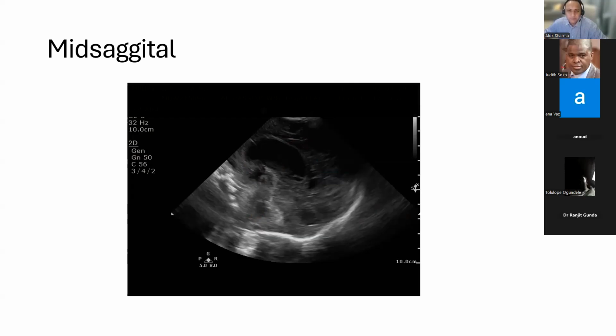Now he will be 34 weeks plus, I think 3 days, like this. Yeah, so you're basically going to undergo a white matter change. And when you have white matter change, one of the changes of white matter injury is basically a very thinned out corpus callosum, which is poorly developed. So you might be seeing some of that at the moment.